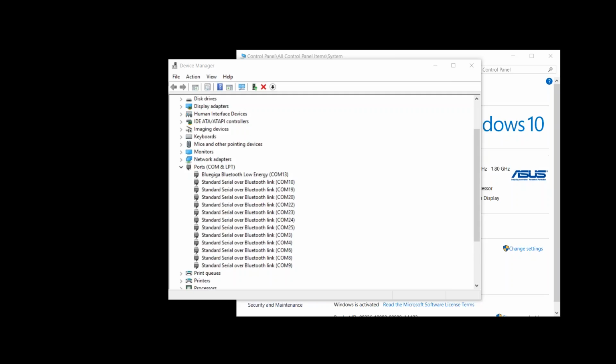Any news on the 6-channel app? Besides Muscle Monitor, and if you mean mobile apps, no, the date is not set yet. We'd have to check with either the sales or product manager about that. So I cannot give you any date for that.